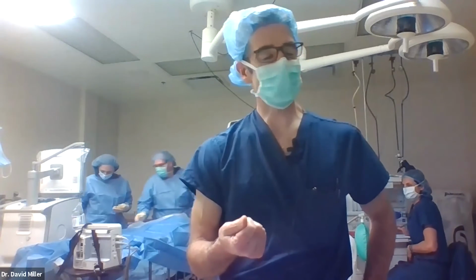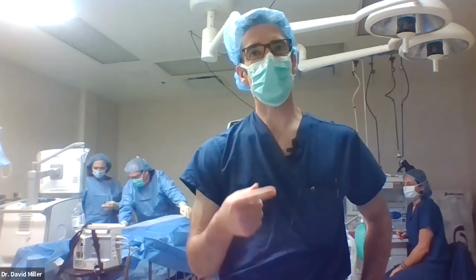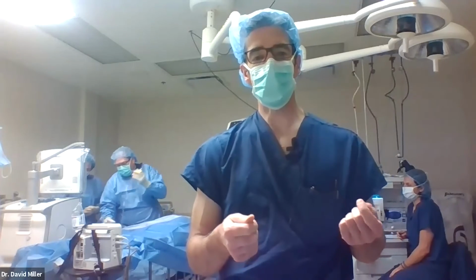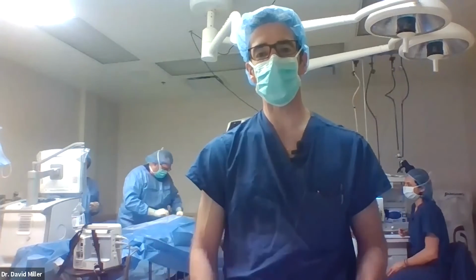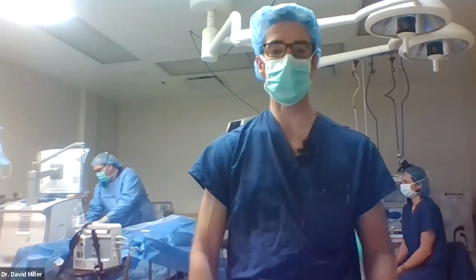I'm right-handed. I grew up very strongly right-handed. I couldn't do much left-handed at all. But you want to kind of push yourself as you're doing surgery over the years to use your left hand. Otherwise, maneuvers get much more difficult. It's much simpler to fix a retinal detachment if you can flip your hands back and forth like that. So I would encourage anyone to try and get a little bit ambidextrous if they can. I mean, if I did it, I think anyone can do it, really.